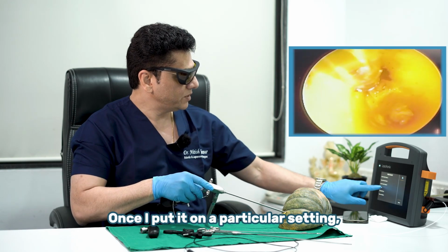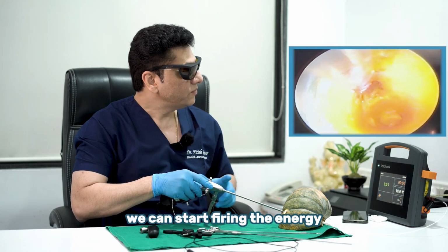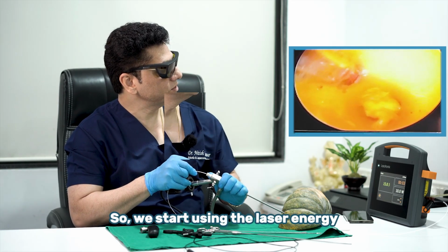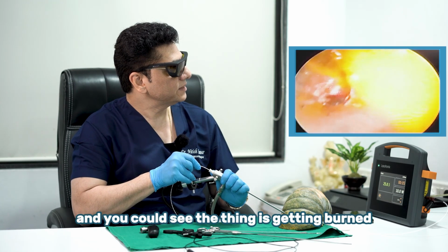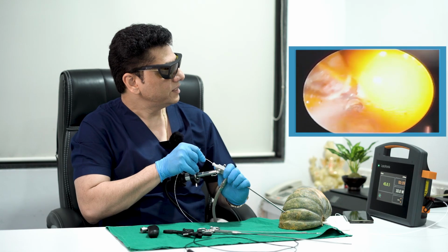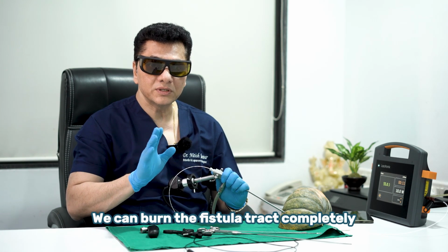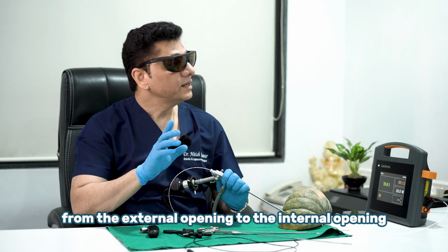Once I put it on a particular setting, we can start firing the energy, and that will burn the fistulous tract. So we start using the laser energy to burn the tissue inside, and you can see the thing is getting burned, and that is being done under vision. As we keep on doing all around, from the external opening to the internal opening, we can burn the fistulous tract completely from the external opening to the internal opening.